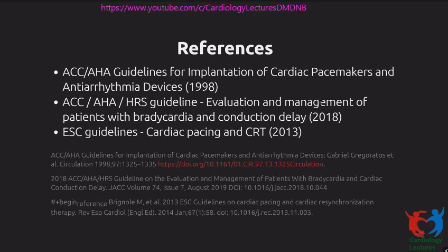So sinus node dysfunction patients always use DDD, but if the patient has AF, then it is said that VVIR is better. What's the reason? Now, so AF and sinus node dysfunction. Now, you have to decide whether it is persistent AF or not. So that is the first question. So is it paroxysmal AF or persistent AF?